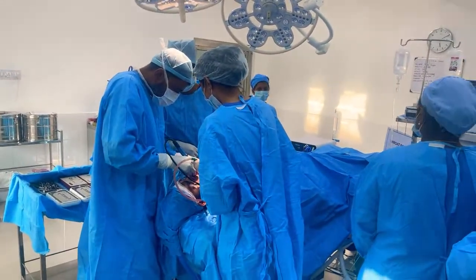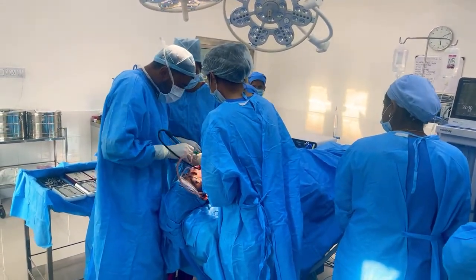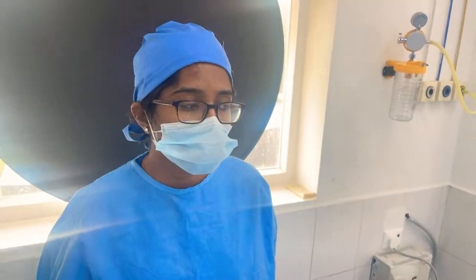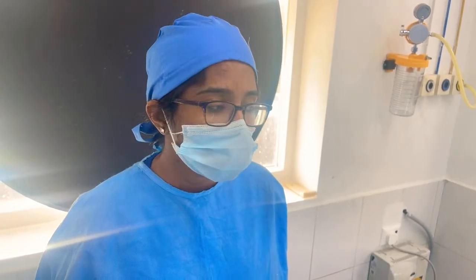Right now we are doing osteotomy on the chin segment, the segment which we are going to advance, and this is being done with the help of a surgical saw, as I said earlier. Although we can do it with just an osteotome, but that is time taking. Saw is much faster.